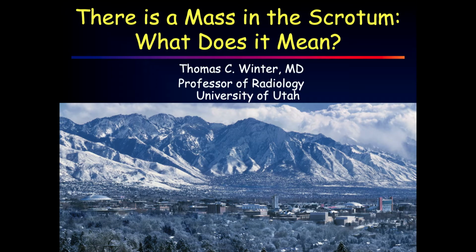So we'll flip over. We're going to talk about ultrasound, a subset of ultrasound in the scrotum. And this is probably one of the most important subsets other than torsion. And this is what to do when you find a bump in the scrotum on your scrotal exam.